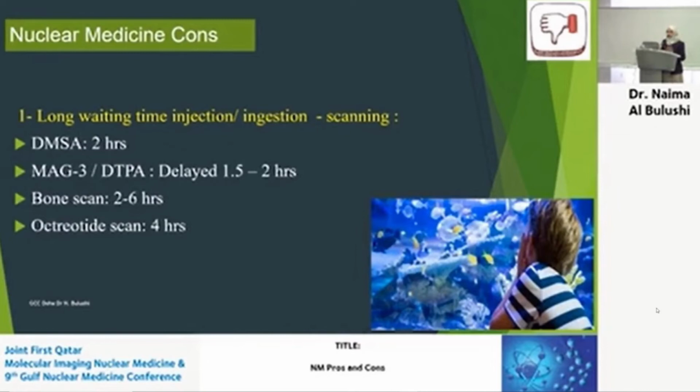Now, what are the disadvantages? What are the cons that we can see when it comes to nuclear medicine? A long waiting time. This is one of the things that we do have in nuclear medicine, and we have to admit, between the injection and ingestion, we have to have the patient waiting for a long time in our department so that they will get scanned, and this is part of increasing the target to background ratio.